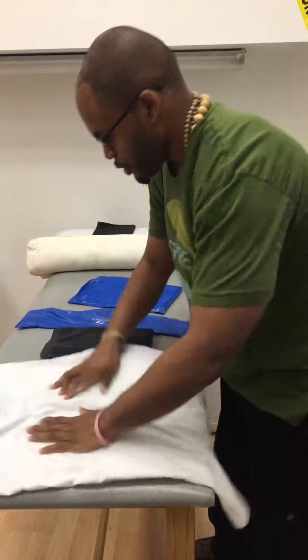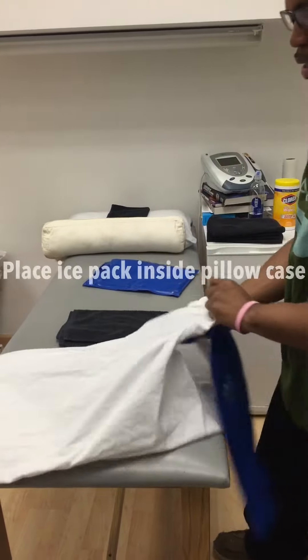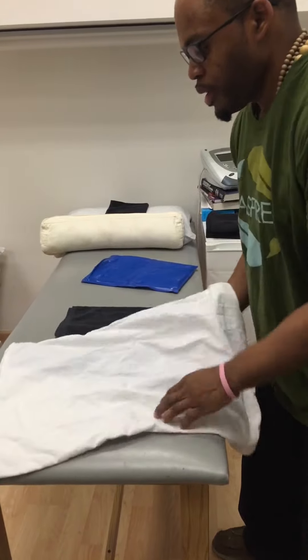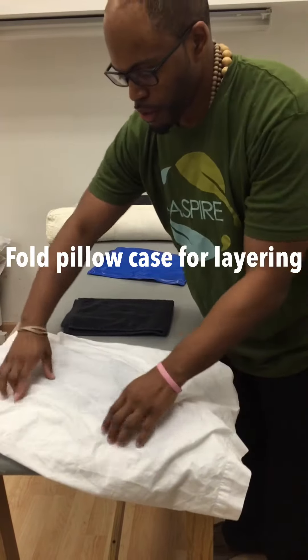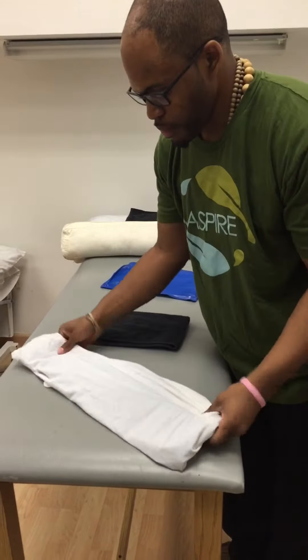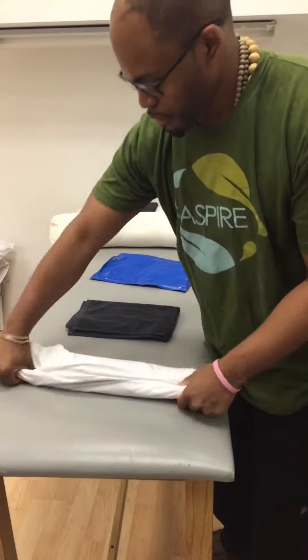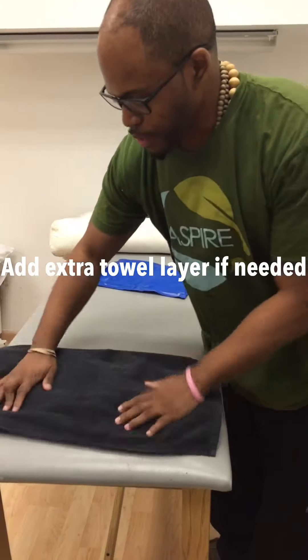Very simple. We take either the cervical or the lumbar ice pack. Put it very carefully into the pillowcase, fold under, front and back. The top side would go to the area that's being treated, and then we would apply a towel over the area.